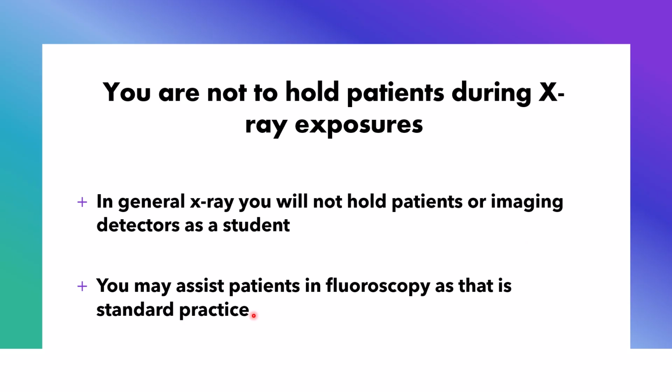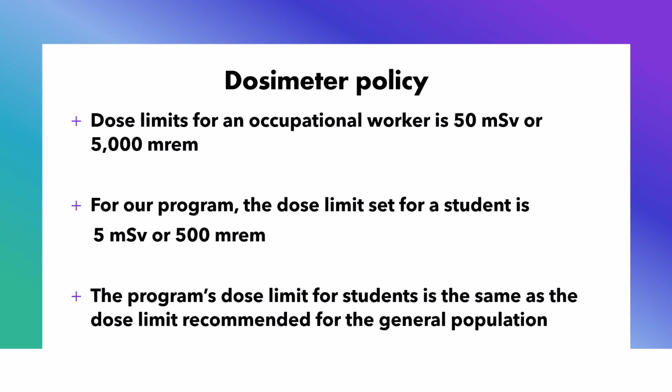You can stay in the room as a student when you're assisting with a fluoroscopic patient. It requires the personnel to be in the room during this exposure, which is different from just doing a general X-ray exposure. Fluoroscopy, you can be in the room. Again, you should not be the one holding the patient, but you can assist in other ways.